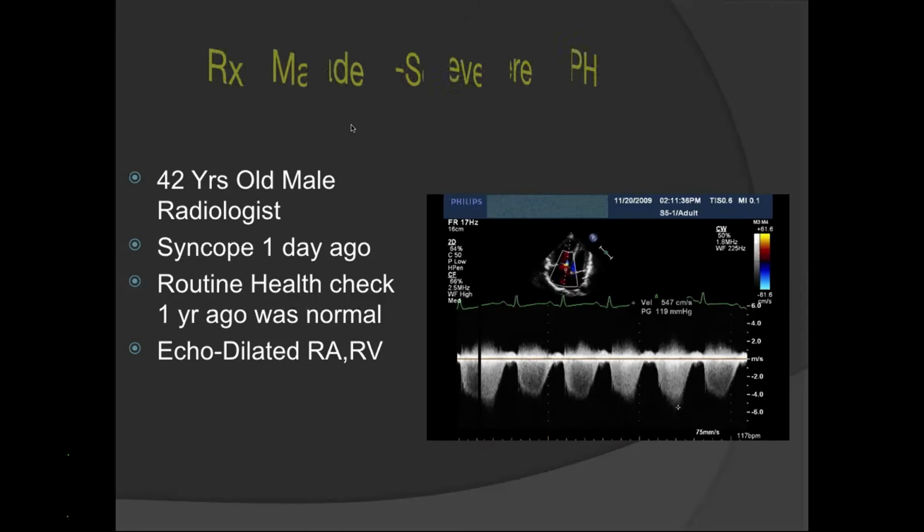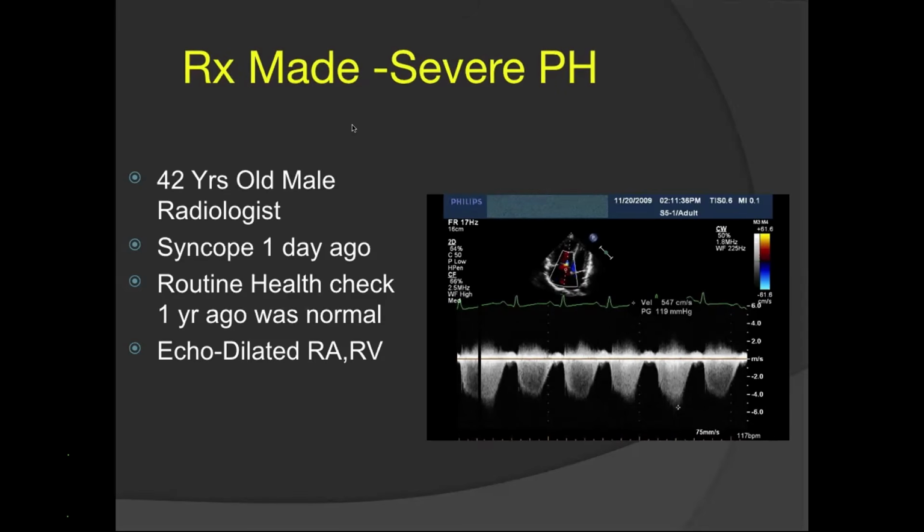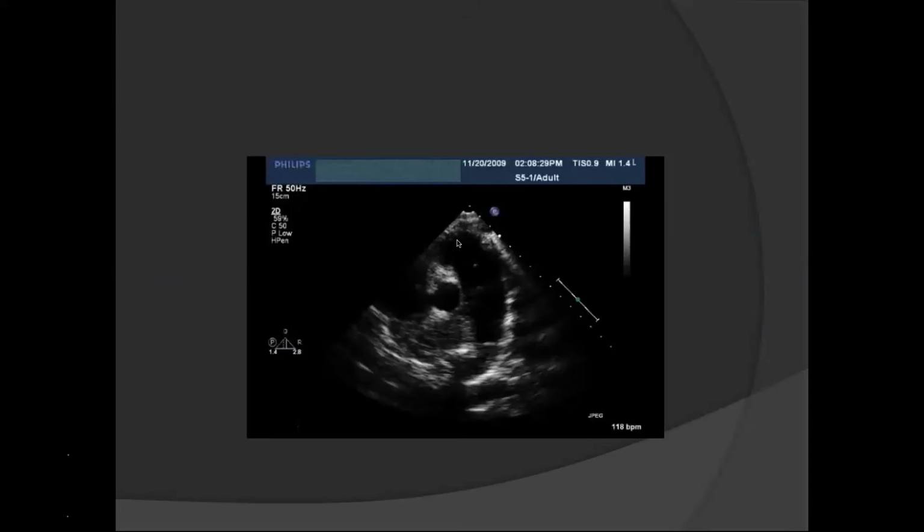Why not pulmonary hypertension? Clearly, the first diagnosis, not by Dr. Hansa, but by us, was that the patient has severe PH. Our diagnosis is confirmed. But we made this basal short axis view, tilted it upwards. Pulmonary artery is seen, pulmonary artery bifurcation is also seen. And what we could see clearly was right pulmonary artery completely filled with thrombus.